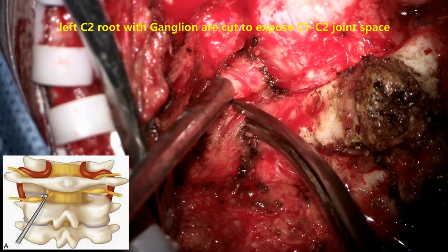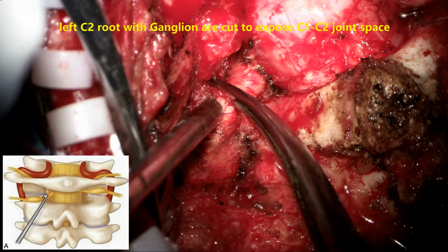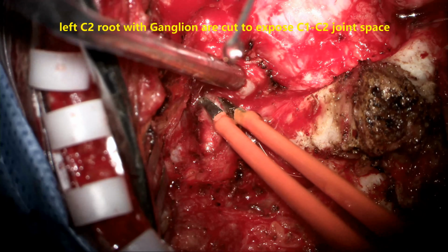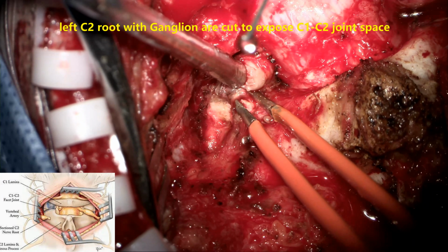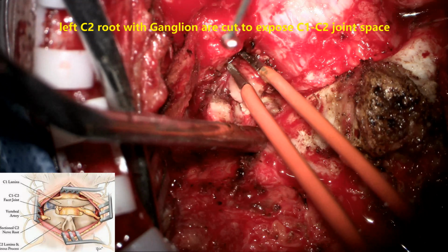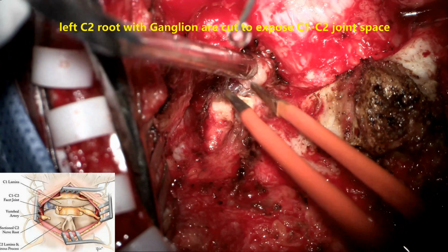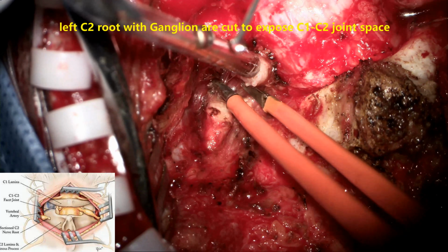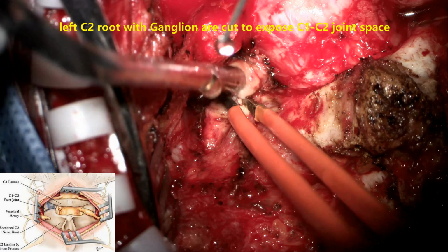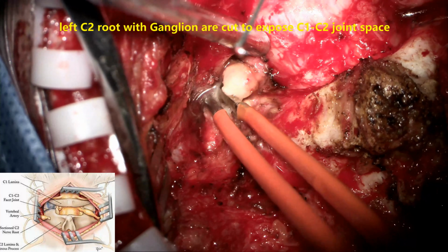During this procedure, we come across an extensive extradural or extraspinal venous plexus in the way, which causes significant bleeding at every step under high illumination and high magnification. We need to understand this and keep coagulating and keep the area very clean so the anatomy is not distorted.